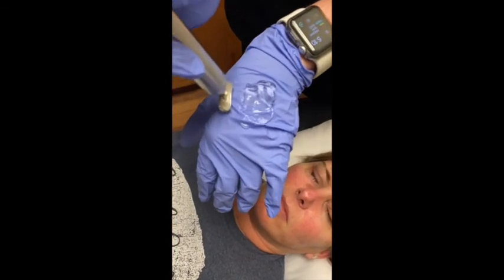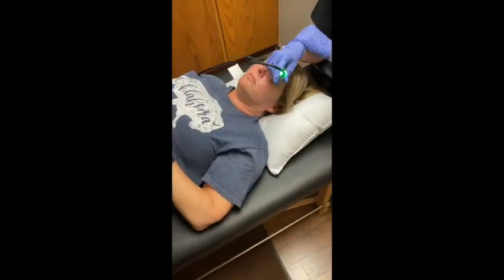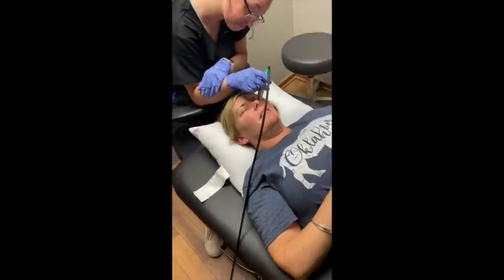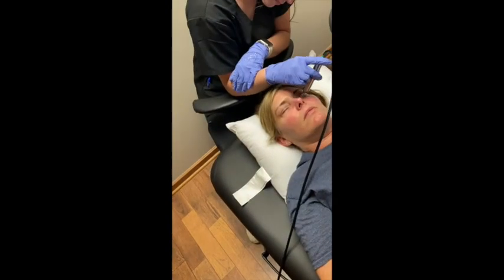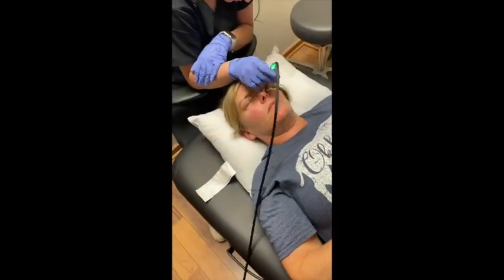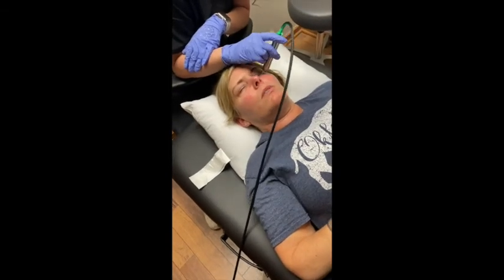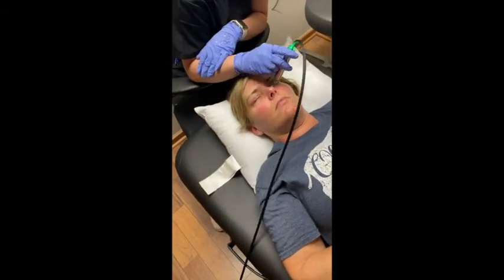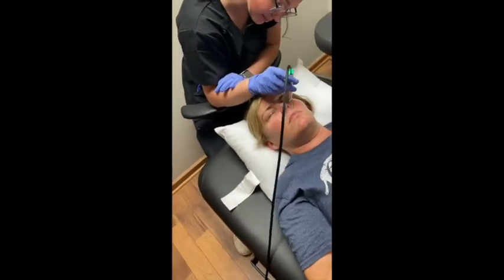And so you can see quite a bit of difference there. Yeah, in color. So now I'm going to speed the video up just a little bit to help get through that whole 10 minutes on the left eye treatment. But you can see Claire continues to work the MiBoFlo treatment there on her left eye for the full 10 minutes, and there's no pain, none of that kind of stuff going on.